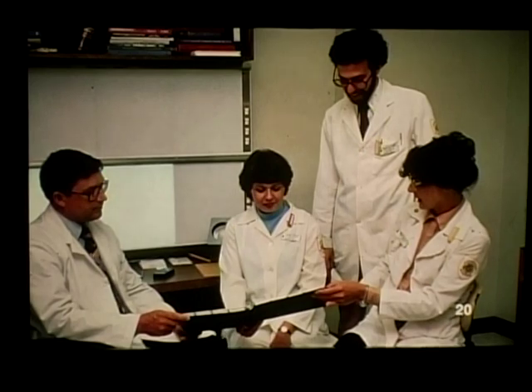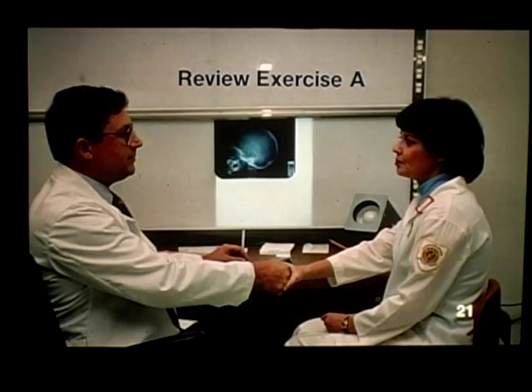Number 20. The Quality Assurance Committee should meet regularly to determine if the program goals are being met. This can be accomplished using such evaluative measures as reviewing the reject analysis and critiquing radiographs passed as diagnostic. The committee also needs to discuss problem areas as they are identified. It is important to stress that any successful quality assurance program is only as good as the administrative support the program receives. One person should not be expected to carry out all of the quality assurance tasks. The idea of a team effort must be emphasized.